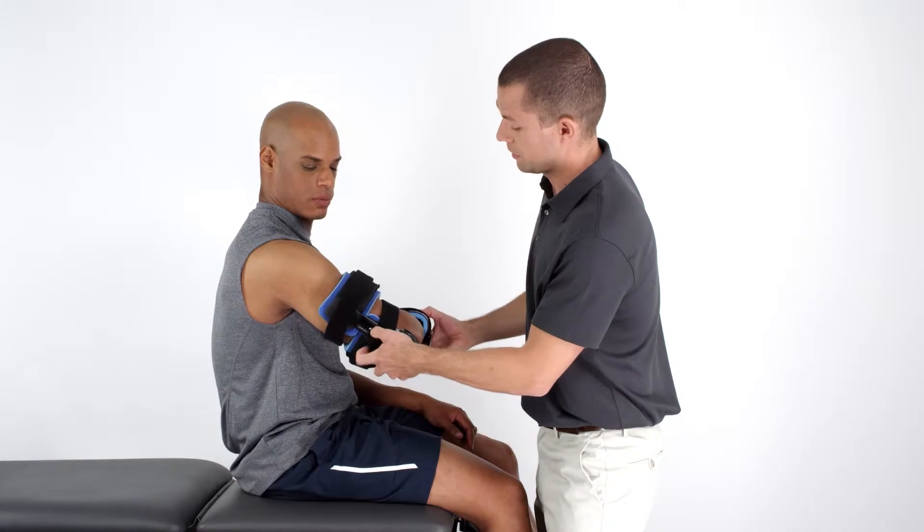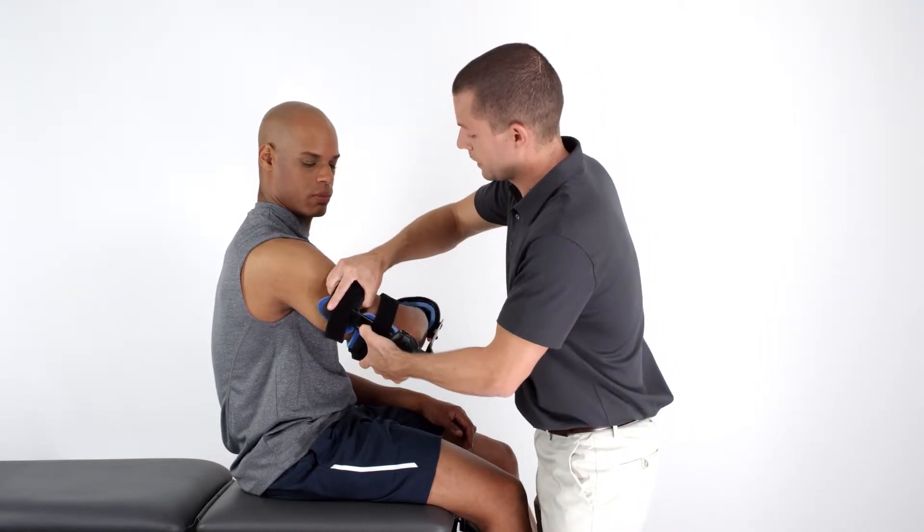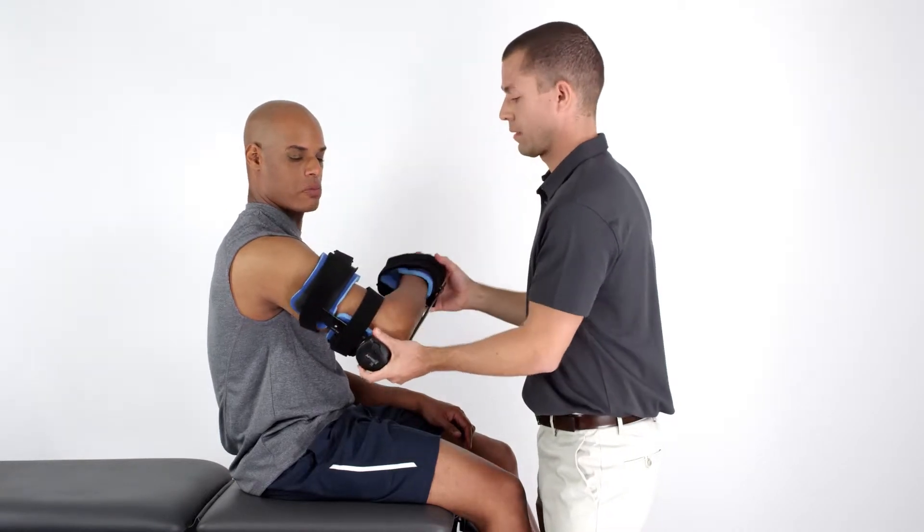depress the leaf pin on either the distal or proximal strut of the orthosis and increase or decrease the length as needed.